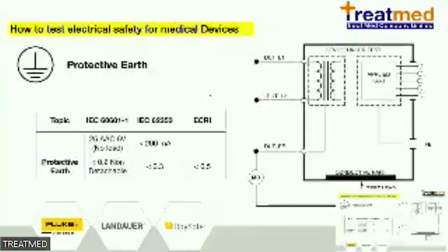Okay, so we start the second section, the protective earth testing of the electrical device, and I will switch the camera to demonstrate.